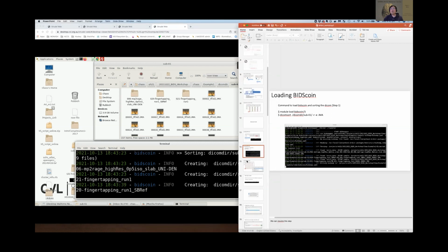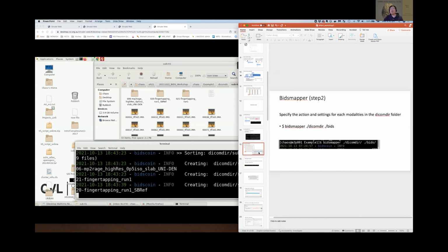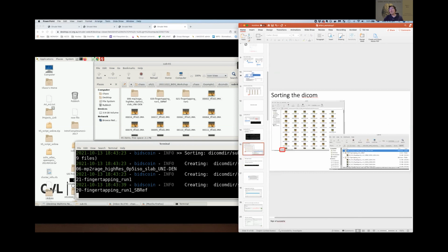While it's loading, I'll quickly go through what comes next. After that, you will see the end product will be a few subfolders in here, where the DICOM goes to where it should be. Those subfolders are actually the modality. In here, we're just doing the typical structural and the functional MRI. This is a task-based functional map. And then there is a field map, which is something that we will leave out as an example.